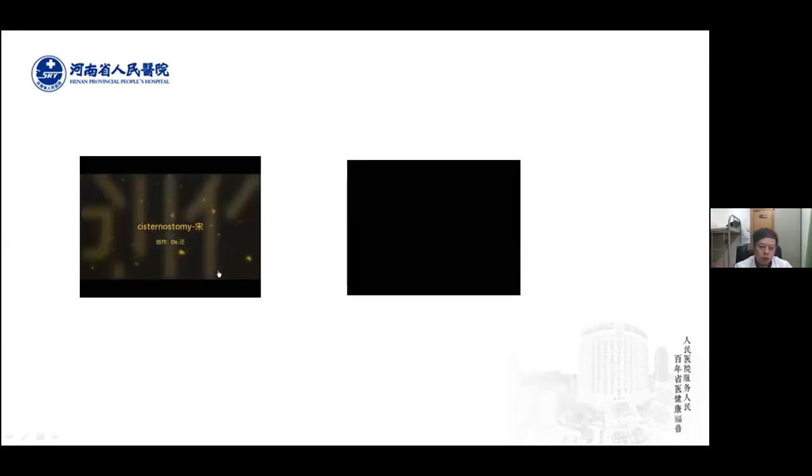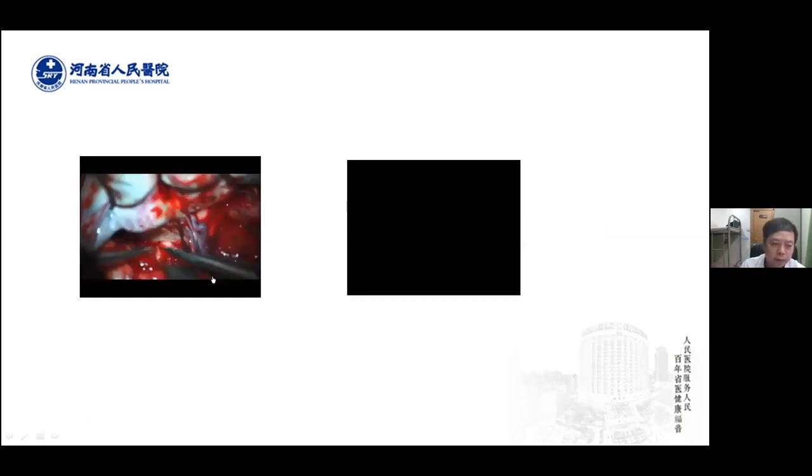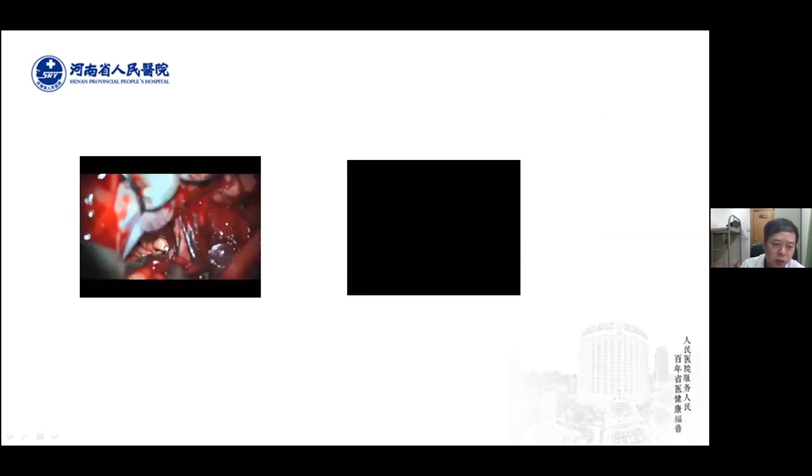The short video is here. From the video, we can see many hemorrhages in the subdural hematoma. Yes, a lot of CSF with blood is here.